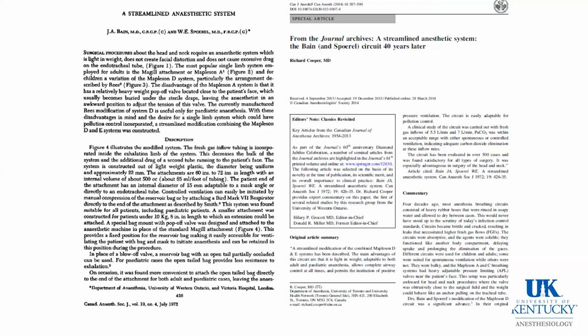Yet I believe that as consultant anesthesiologists, you should be aware of the Bain system and know how to use it. You should be aware that if the inner oxygen supply tube is disconnected, the system will malfunction. The special article probably accurately summarizes the international use. Rarely in North America. In fact, as I just mentioned, we cannot buy the Bain system any longer.